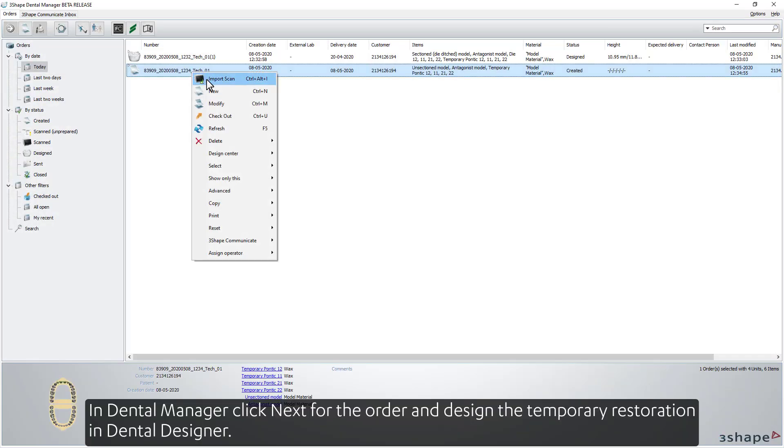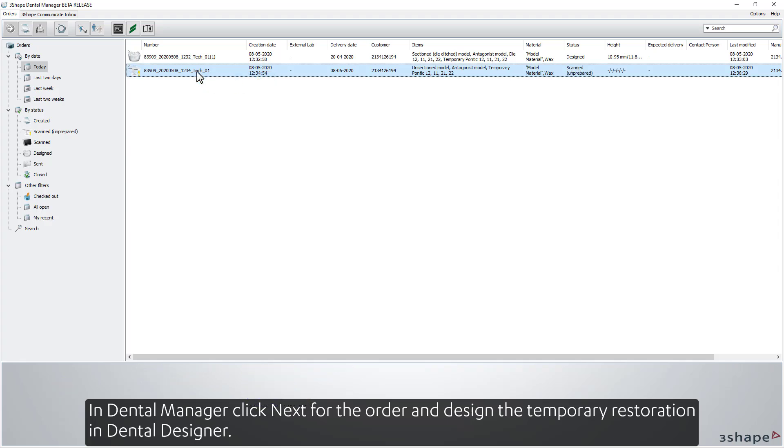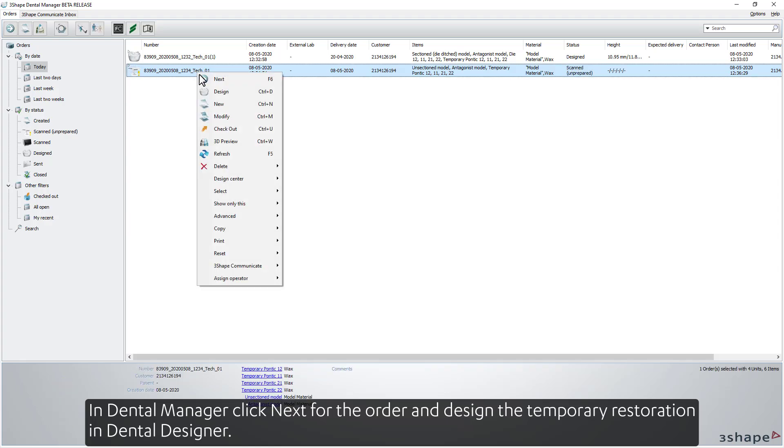In Dental Manager, click Next for the order and design the temporary restoration in Dental Designer.